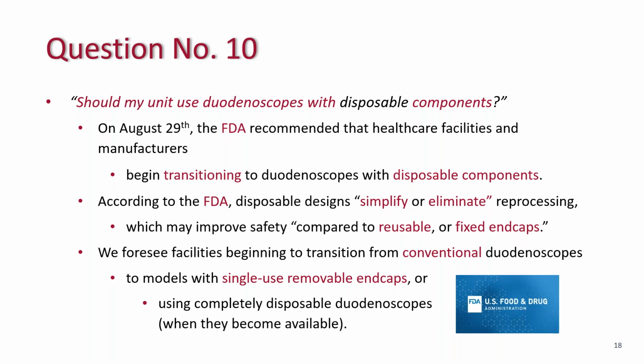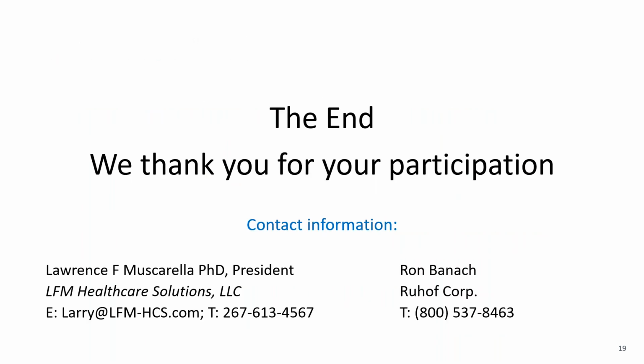We talked earlier about a bronchoscope having components at the distal tip that might fall off in the patient. We want to make sure that the designs of these duodenoscopes do not also encounter that. Sometimes you can solve one problem and create another, and I'm not suggesting that's happening here. I'm simply raising questions that this may not be a panacea, but we can talk at a future time about mitigations using these disposable duodenoscopes so that we can assure the safety of your patients and the efficiency of your unit. That is our presentation today.